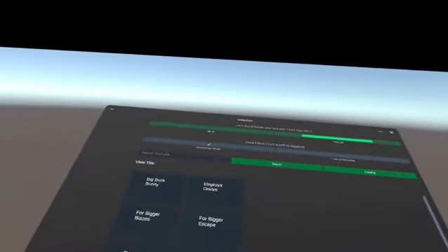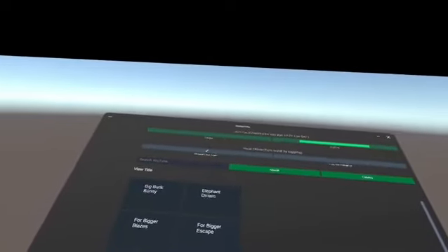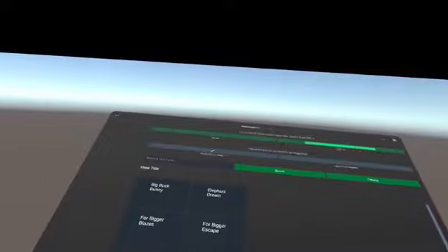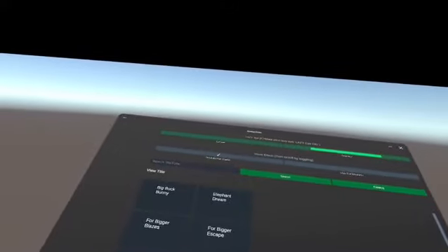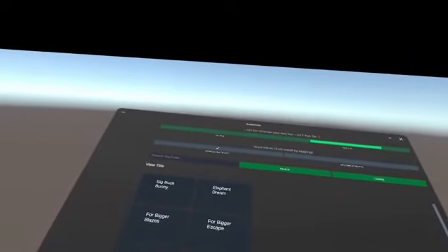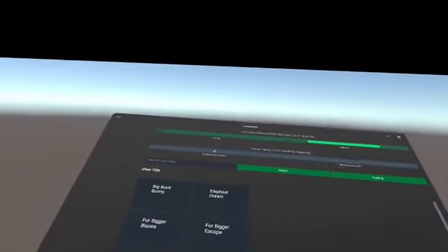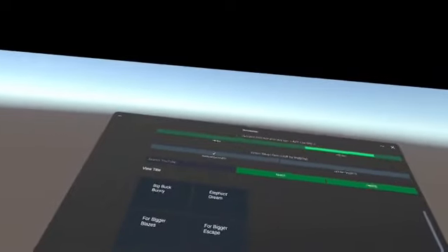So you cannot add flicker in real environments, but the key point of AmblyoTube is you can add some flicker also to the objects, so that your lazy eye gets some attention boost. Okay, and this attention boost is very important. If you do not get this attention boost, then the lazy eye doesn't tend to work, and it relies more on the dominant eye. Okay, so I will quickly show you how this works.